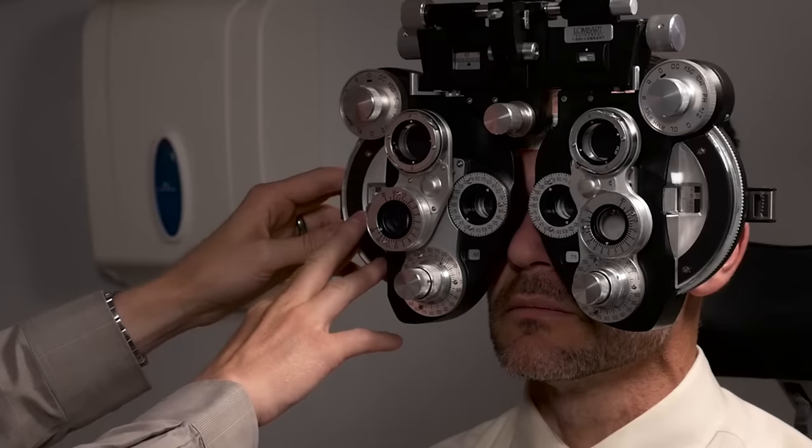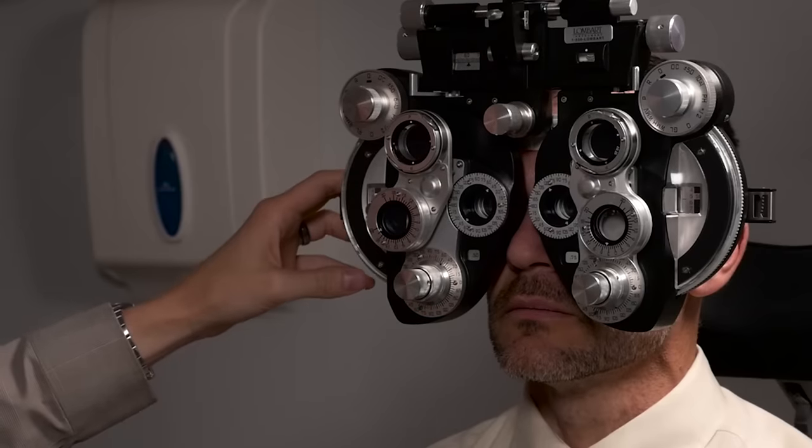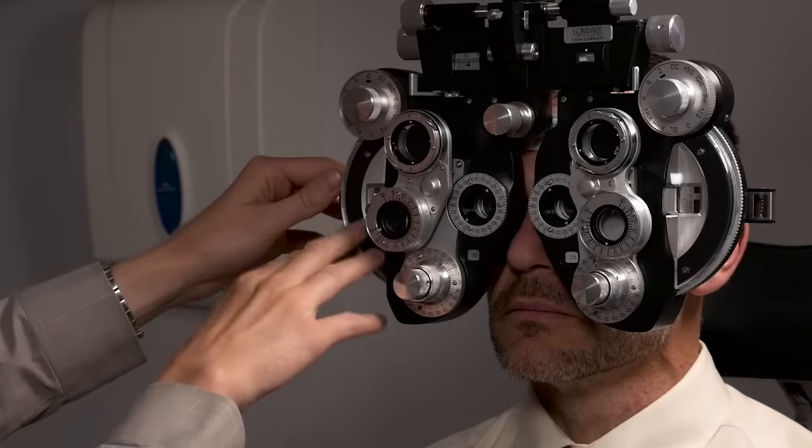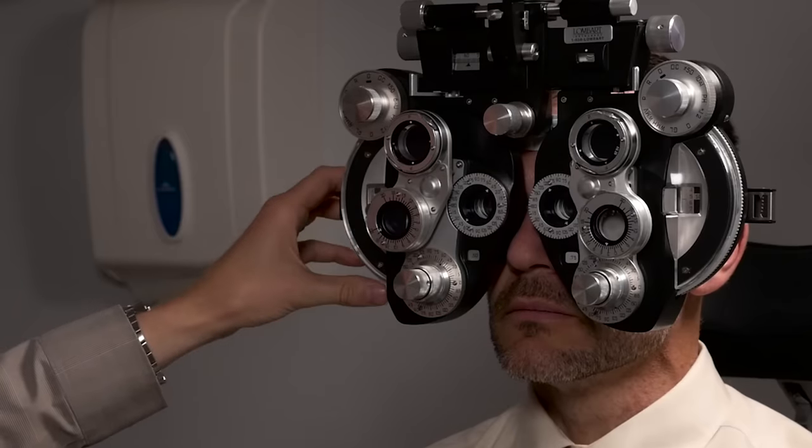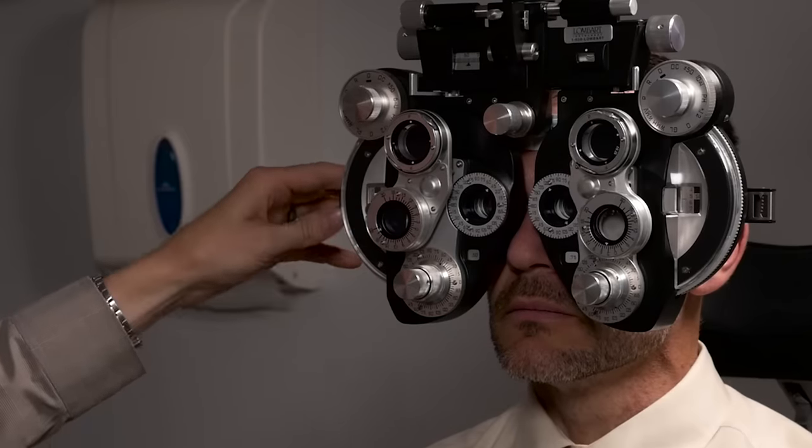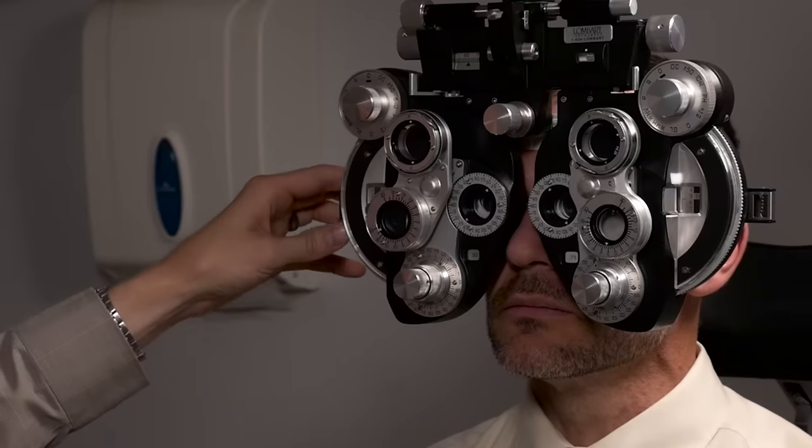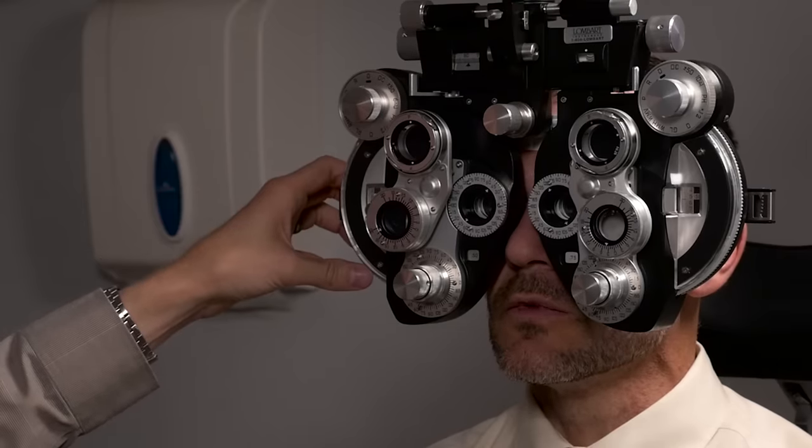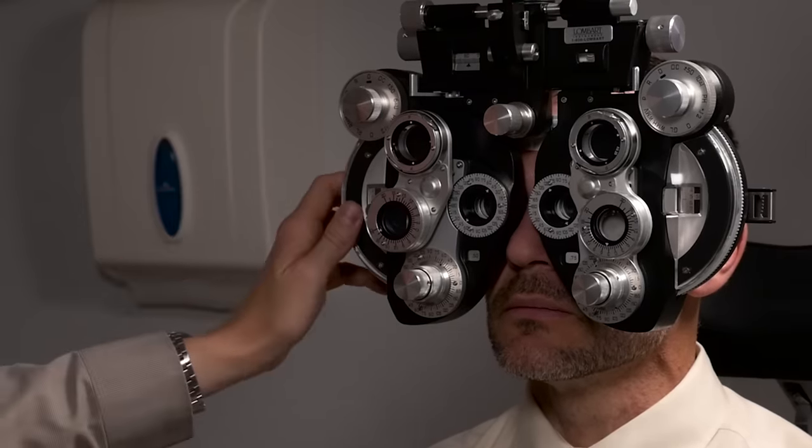And then to go back I'm going to go back to the spherical component and refine that a little bit. I'm going to ask him a few more questions. What looks more sharp and clear? Number one or number two? Two. Okay. Number one or number two? One.